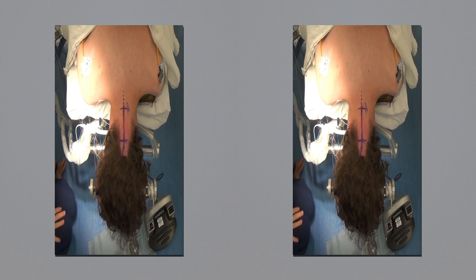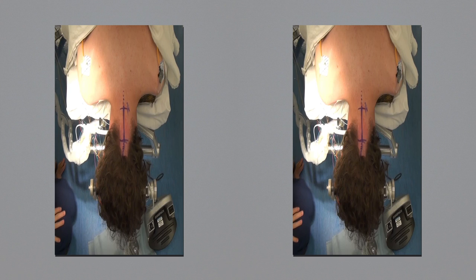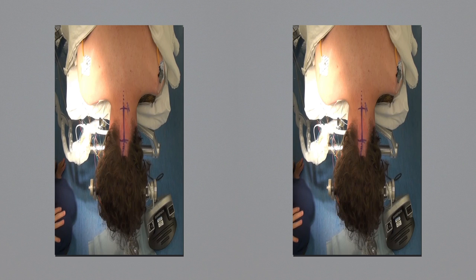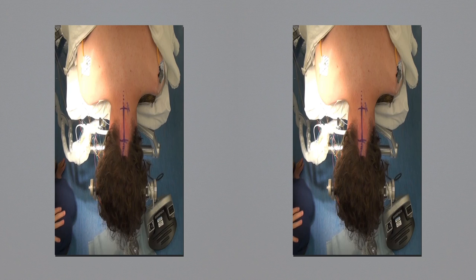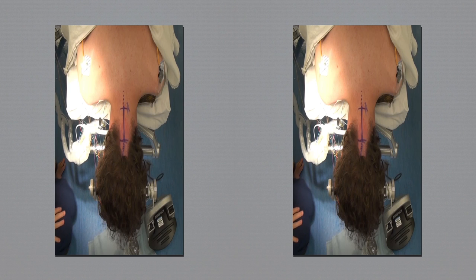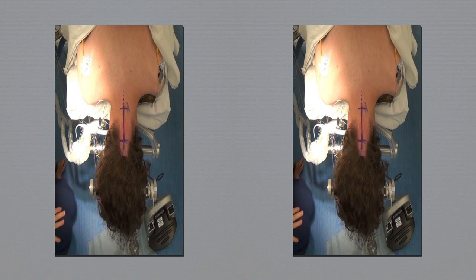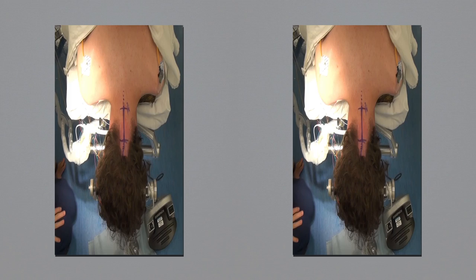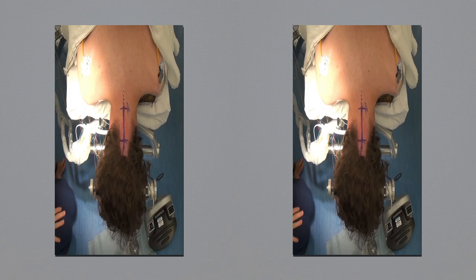The patient is placed prone, and the intraoperative photo demonstrates the skin incision necessary for performing this suboccipital approach. The dotted line demonstrates the possible extension necessary in the caudal direction so that the surgeon may obtain the rostral view necessary to approach this lesion. A significant tucking of the chin and flexion of the neck is necessary for these cases.